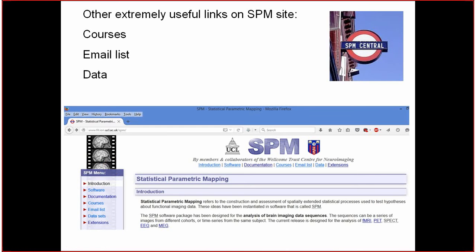A brief introduction to the web page of SPM is always useful, because in this web page, in addition to the software, you have a lot of extremely useful links, which are the courses, the email list, and the data.